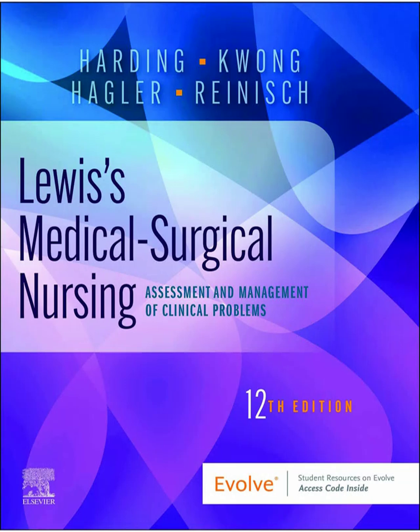Okay. Second degree. Now it gets trickier. Second-degree AV block, type I. That's the Wenkebach, remember the little rhyme: longer, longer, longer, drop. Now you have a Wenkebach. Catchy. It helps. The PR interval gets progressively longer with each beat until finally a P wave occurs and isn't followed by a QRS. A beat is dropped. Then the cycle repeats. It's often transient, maybe related to meds or ischemia. If they're symptomatic, maybe atropine or temporary pacing. And type 2, Mobitz 2.